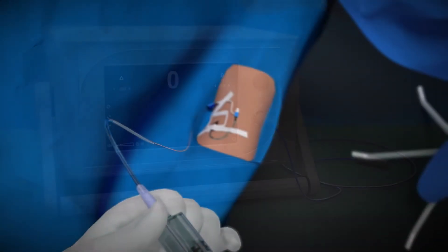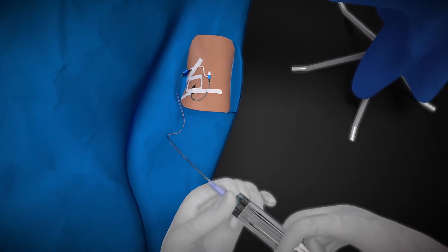Before surgery, patients are injected with a cancer-targeted drug that binds to cancerous tissue.